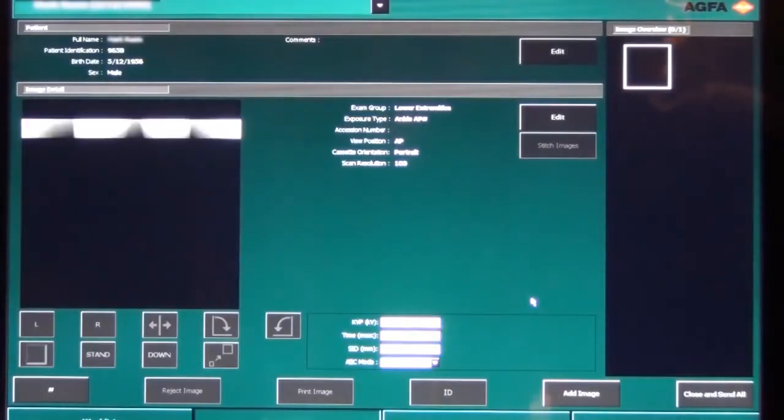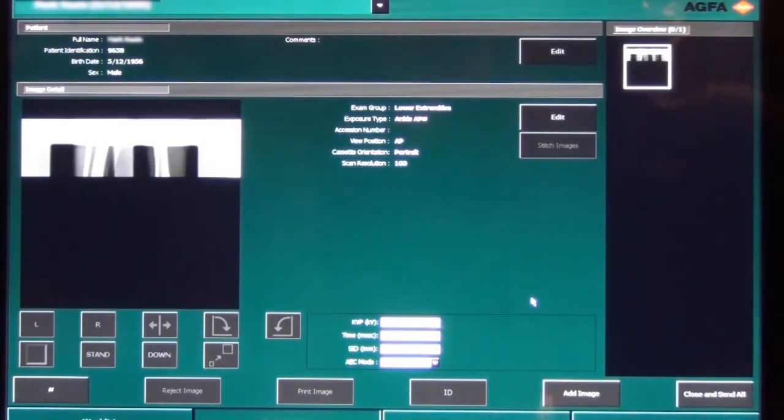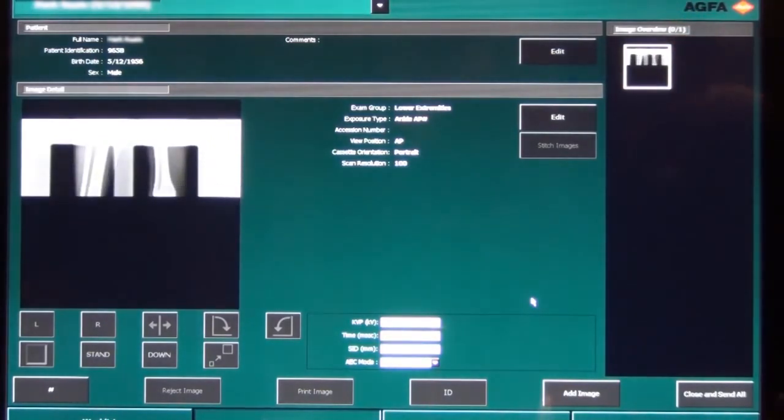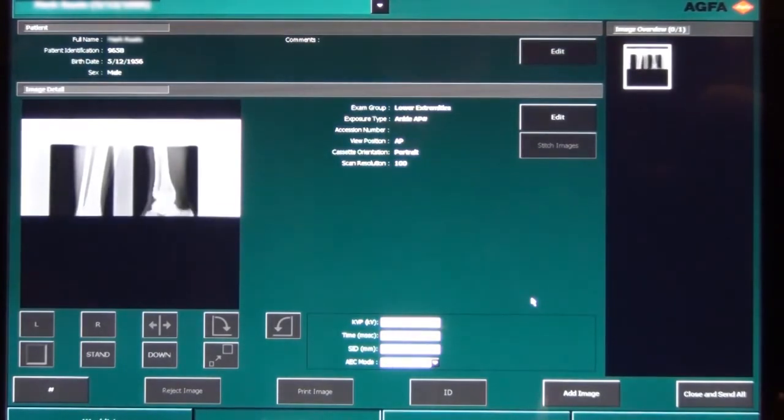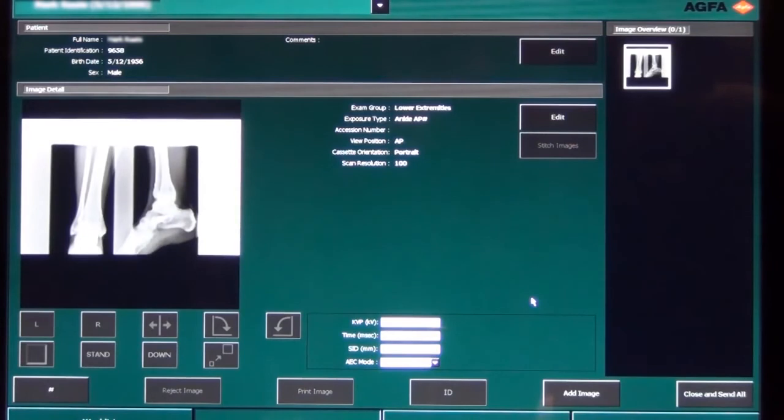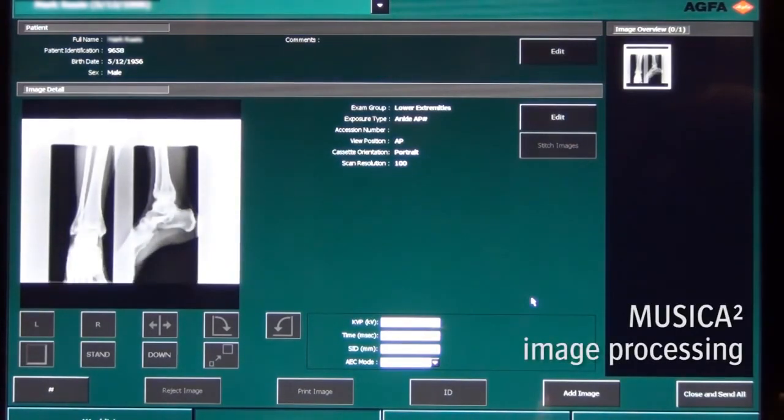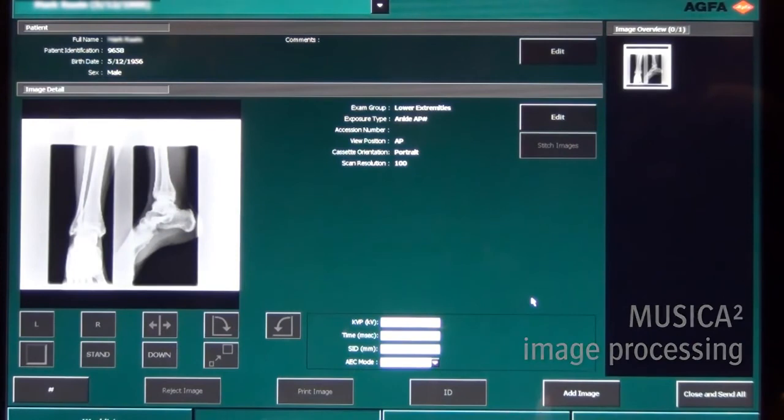While scanning the cassette, the preview image is building up. The white borders that you see are the non-exposed areas as a result of the collimation. When the preview image is complete, it is processed with our intelligent Musica II image processing that empowers your radiology department.